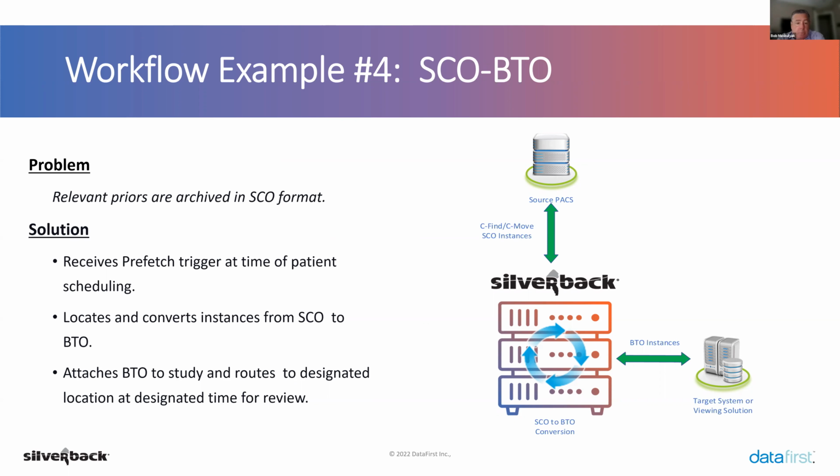The other thing where this is helpful is in those scenarios where you've got customers bringing in CDs that haven't been converted. This is kind of nice. We've seen where, whatever the mechanism is to get an outside CD into your PACS environment, we could then go ahead and enable the same prefetch of those and pull those down and have that conversion take place.